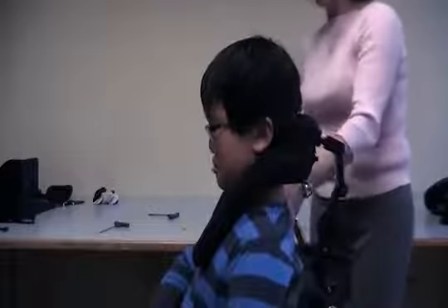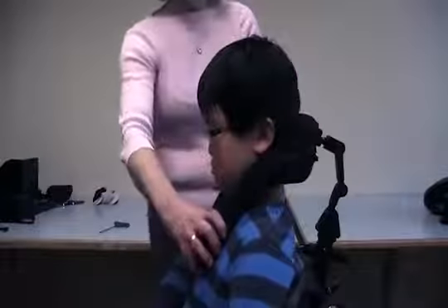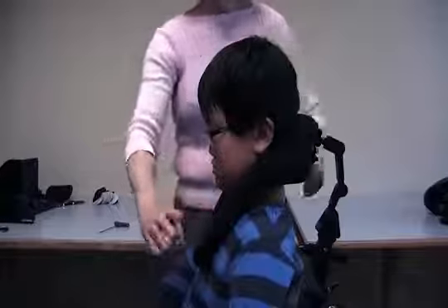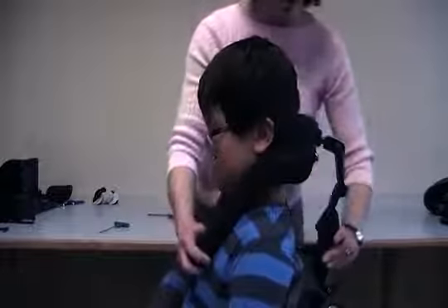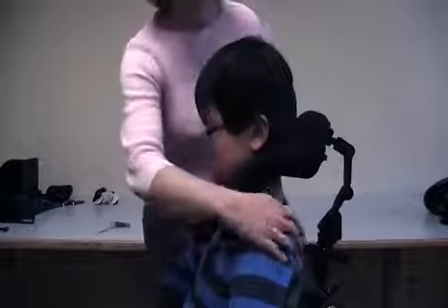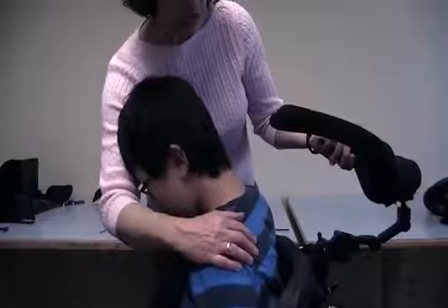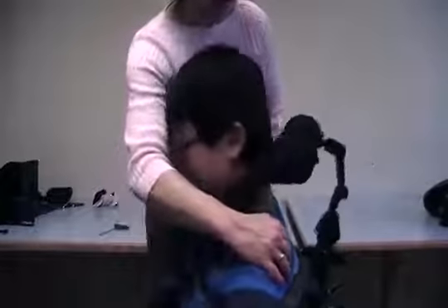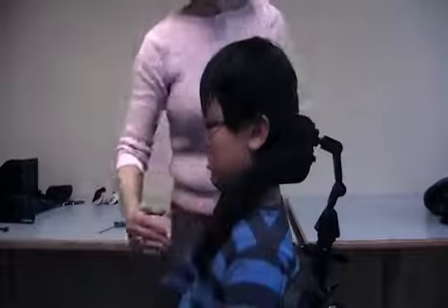When it is time to remove this, there is a version in which these side pads will swing to the side to help with transfers. This does flip over the client's head. By pulling the client forward slightly while moving the headrest back, we can easily position this onto the client.